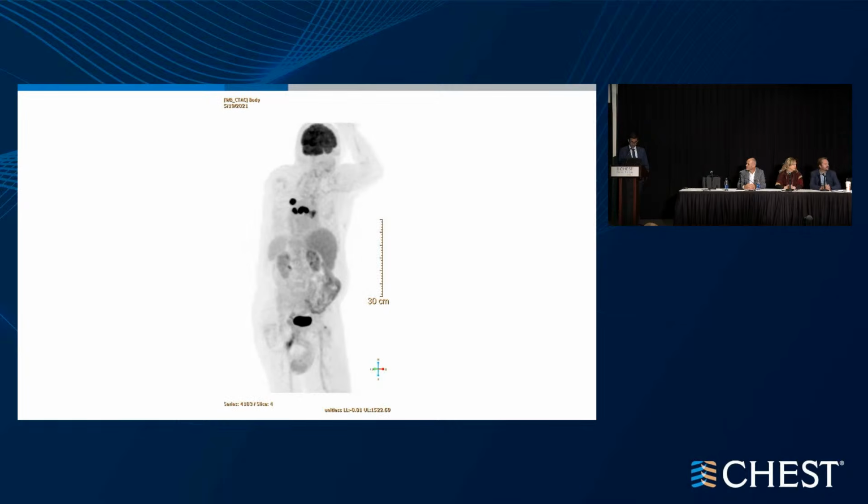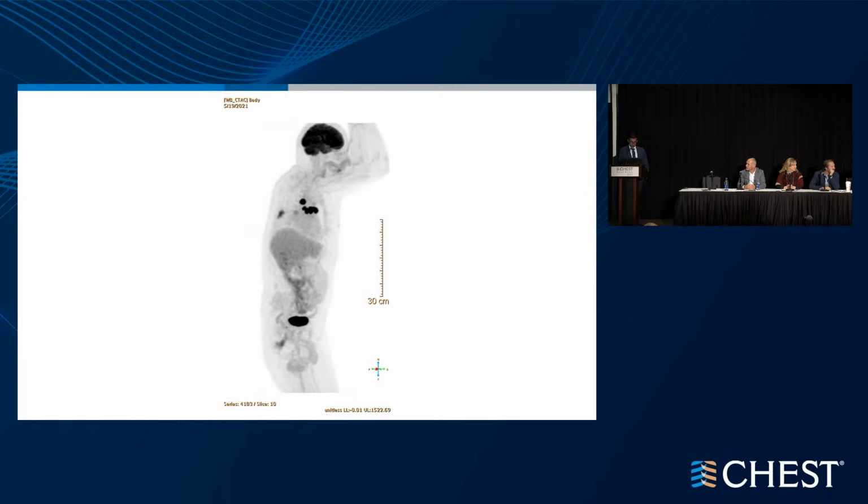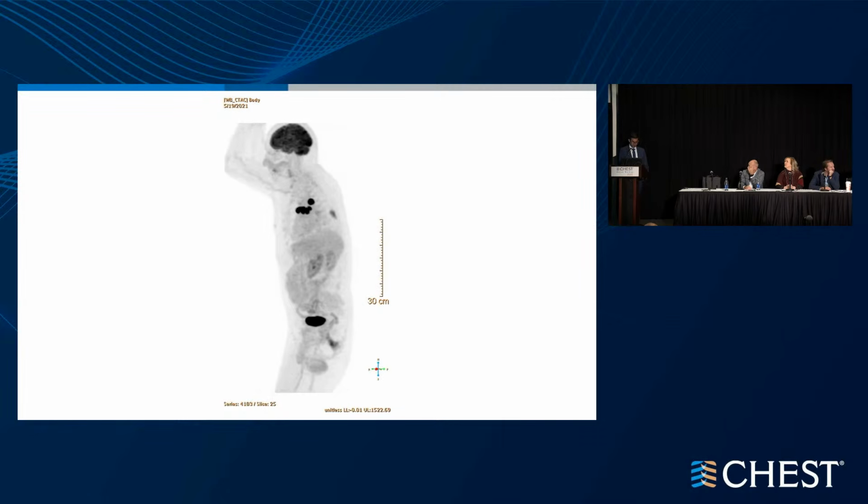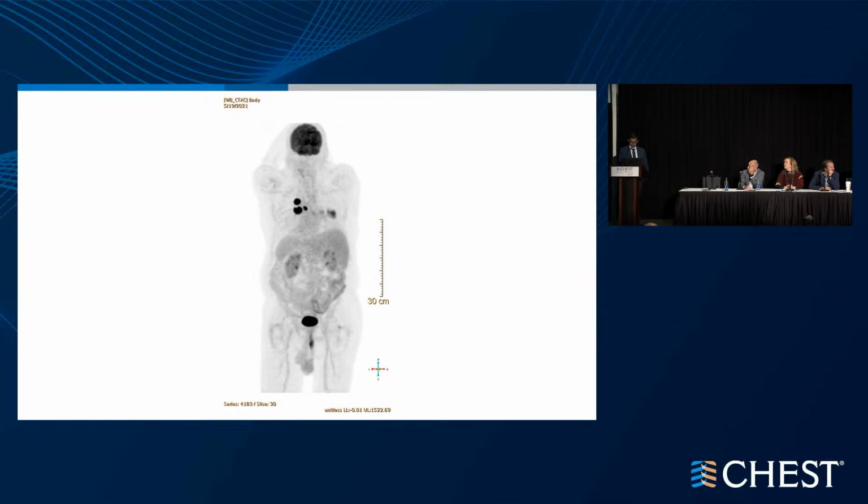But so I do have a PET scan, and I just have the PET man, one of my favorite views of it. As we turn PET man around, you see he's got a lot more PET avid disease on the left in the mediastinum. I'll tell you what our radiologist had given us. So I'll just have PET man spin around and go here.